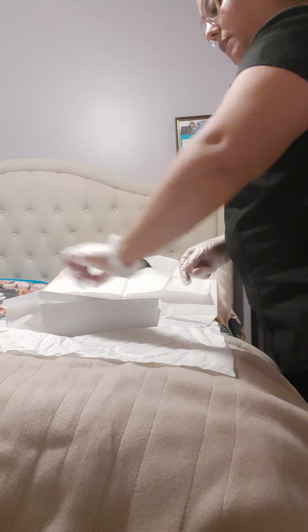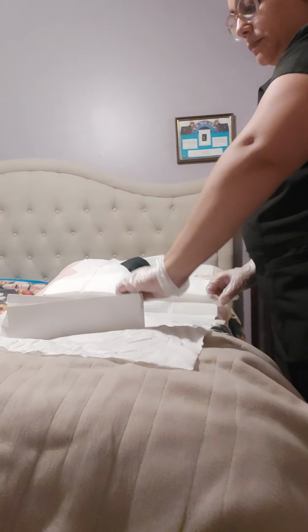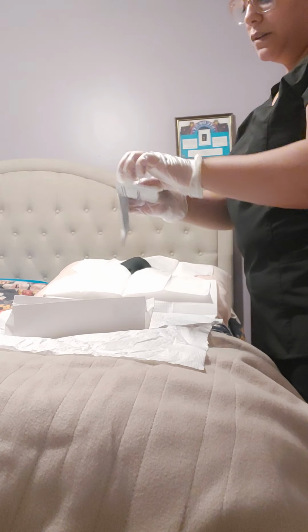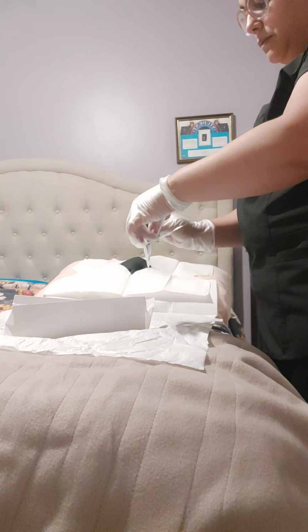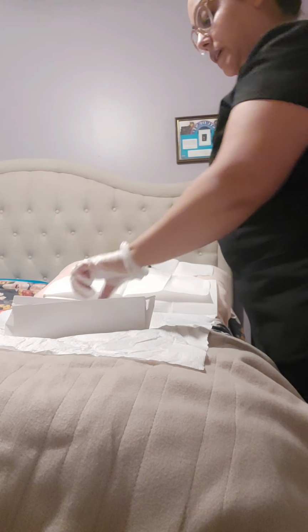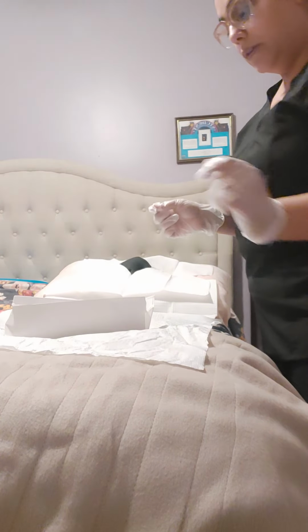Then I will be moving this just a tad bit, and opening my swabs. I like to take them out so that I can just set up my area completely. Place them in my tray. Throw that away in the trash. Then I will be opening my lube, squirting it in my tray, throw in my trash.